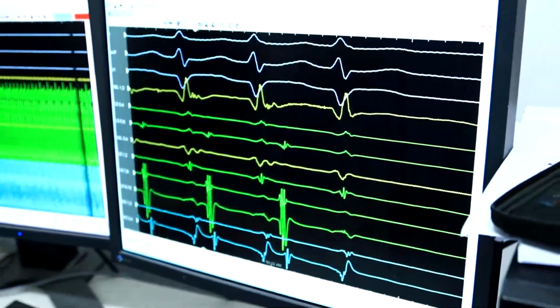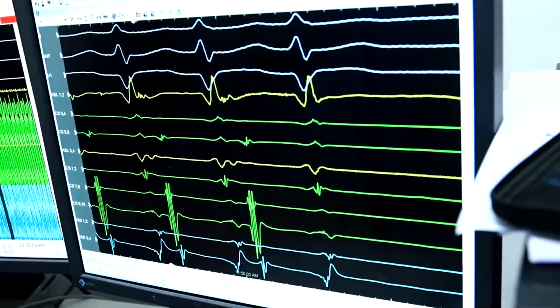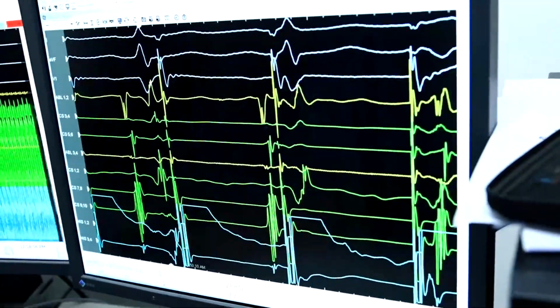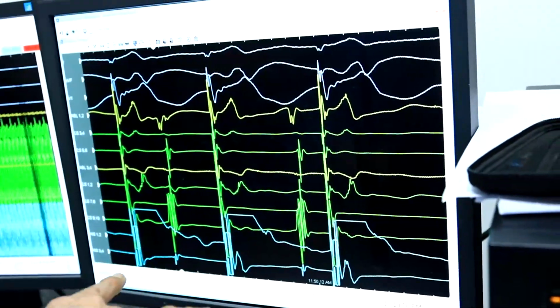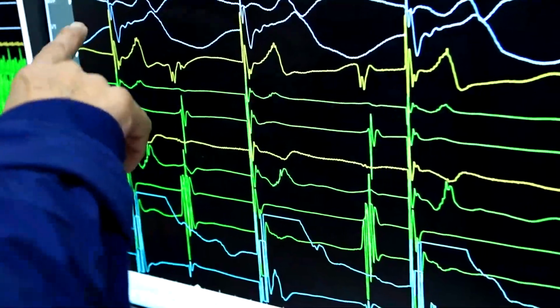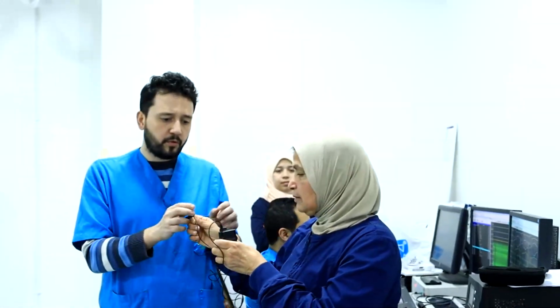This is very strange, but keep in mind that the maneuvers helped us to reach this diagnosis. We continue to see the VA dissociation from the LV when we pace. We kept pacing from the catheter in the tributary, and there was VA dissociation. We stayed and made a good waiting period, and that was good. We'll look at the fluoroscopy.